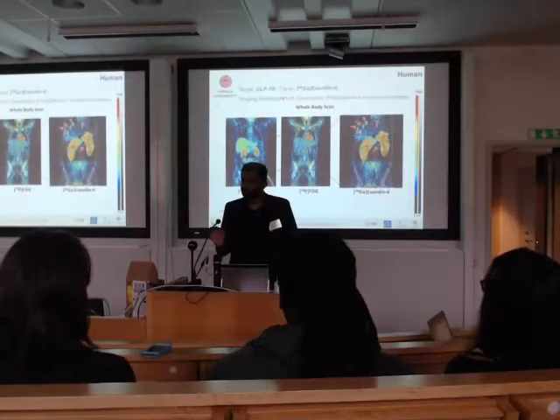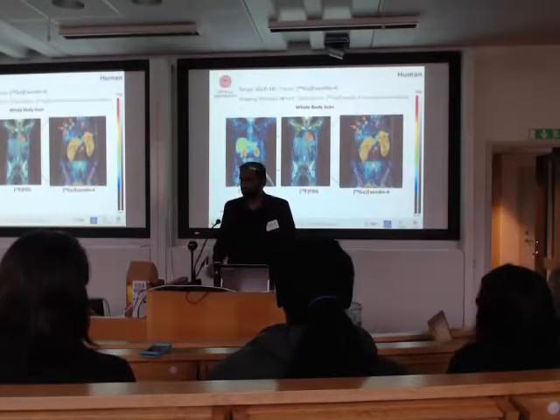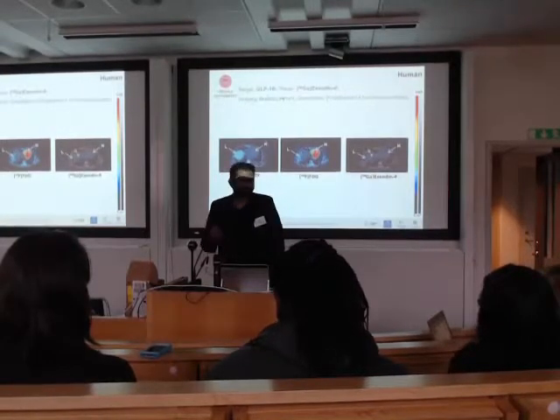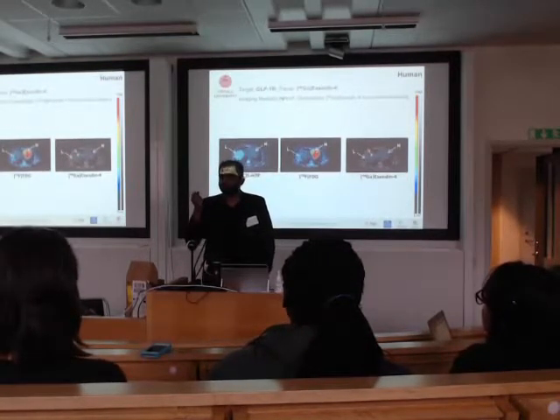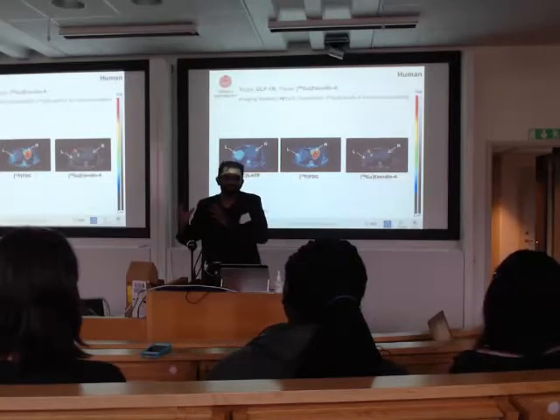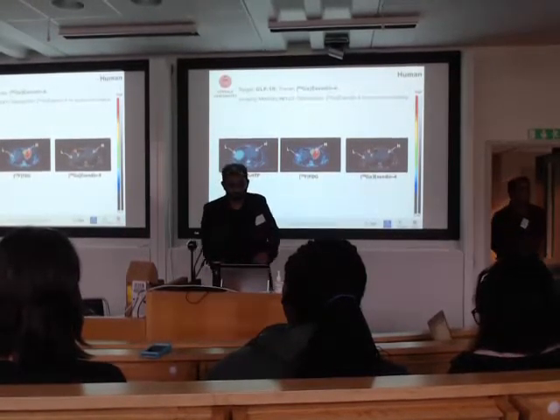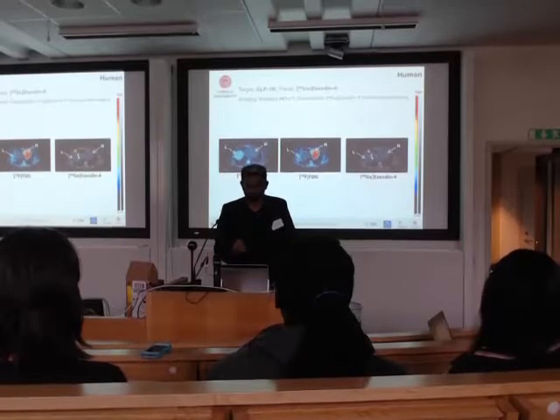This was half an hour post-injection. It clearly pinpointed where the primary tumor was. It showed where the extent of metastasis was. This is one of the happiest days of my life. So this is just to show an example of these insulinoma tumors. As Frederick mentioned, there is a limitation with the resolution of the human PET camera. Best scenario, what I know, is 4 millimeters. So if your tumor is, say, 1 millimeter, that's a huge limitation; with respect to PET camera limitations, you can't look at these tumors. But if you have a higher tumor-to-background ratio, in this case the tracer uptake is almost nothing in the liver, it's just in the metastasis. In that case, you can visualize such small metastasis.